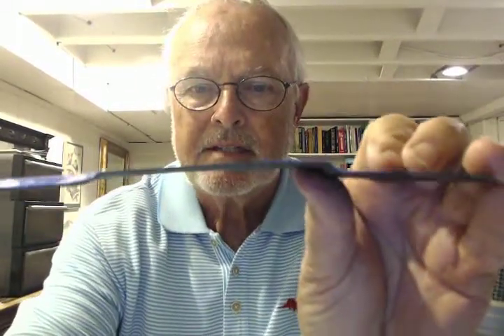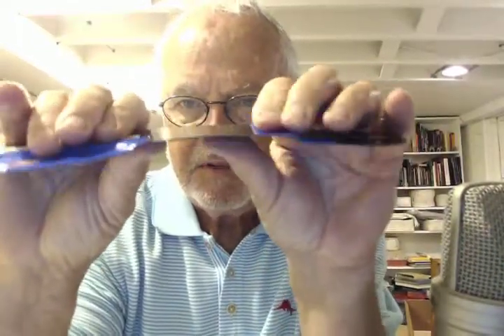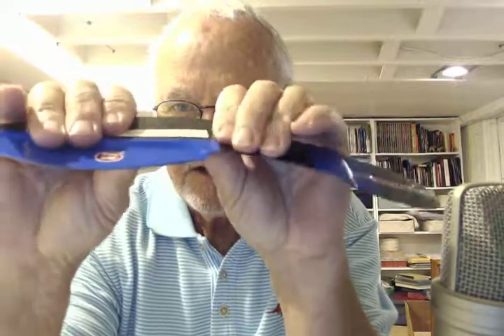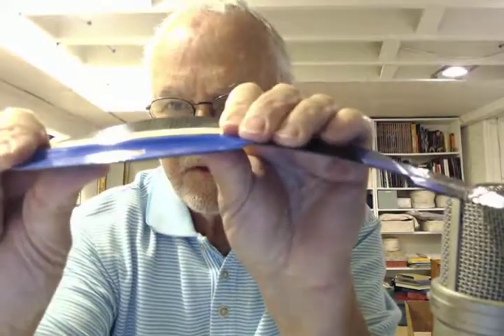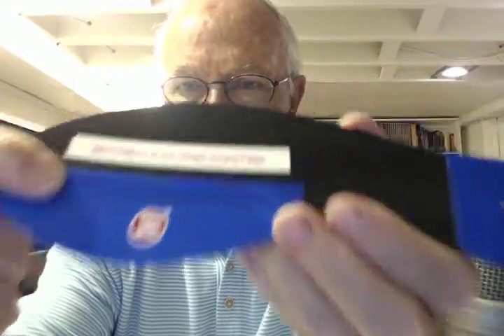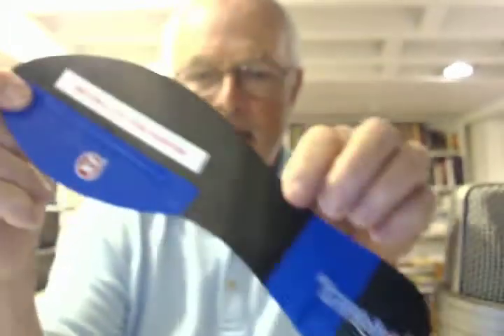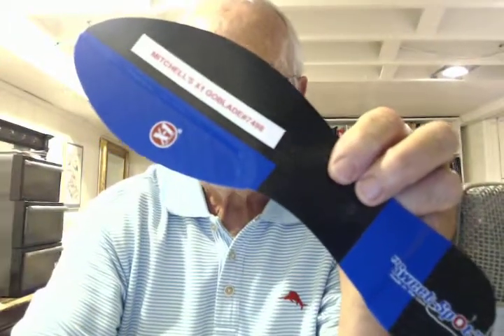Super light tri-flex design, so there's no restriction at all in the midfoot or the rear foot. And as you go forward toward the great toe, under the great toe, that's where it is the most rigid. It's got a two millimeter drop right here. And this should fit quite nicely in Mitchell's dress shoe.